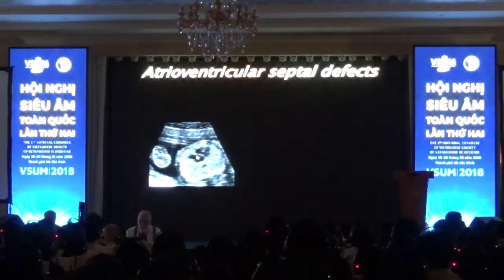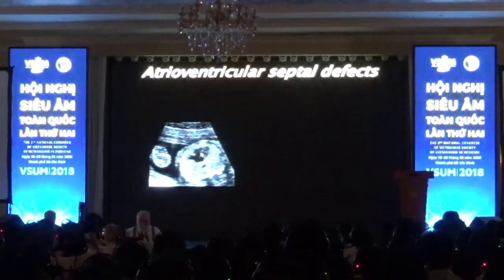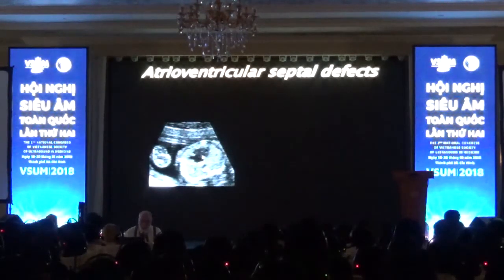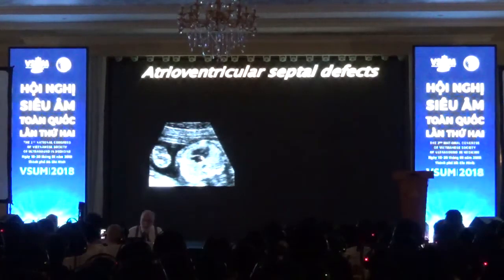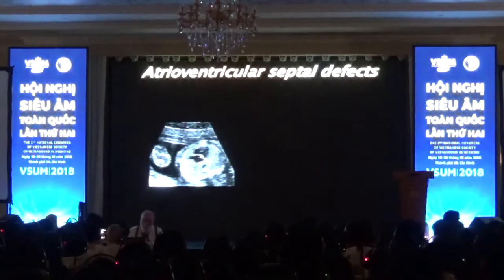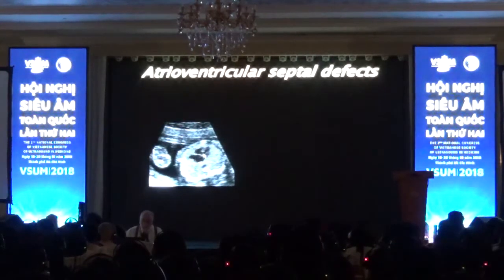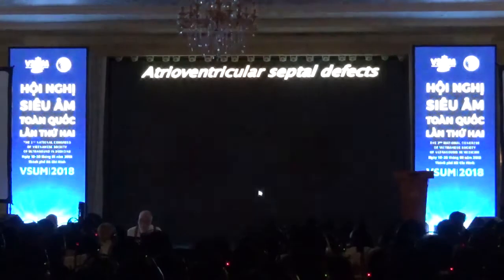This is an early fetus. You can see the baby also has an important finding, the heart rate is too slow. Babies that have atrioventricular septal defect are missing a portion of the septum on which the atrioventricular node is, and so they have conduction delay and they have a slow heartbeat. You see the crest of the septum. Remember I told you yesterday to look for this white echo that tells you that this is not a dropout artifact, and you see the big valve that is opening over both ventricles.